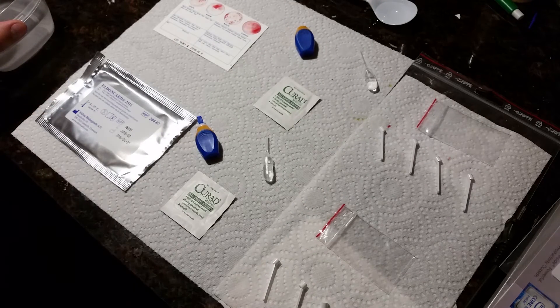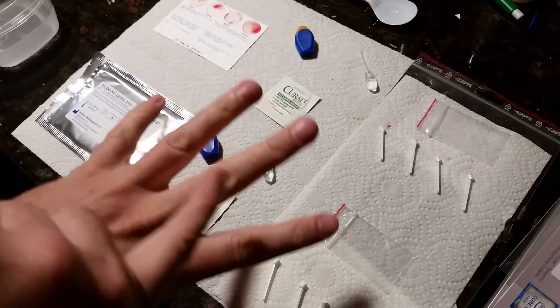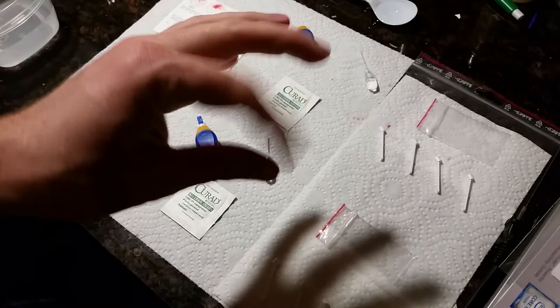I'm using my middle finger this time. Let me get a paper towel and dry it off real fast. I'm going to repeat the same process — my middle finger is the one I'm going to test, and I'll use these two fingers to do everything.